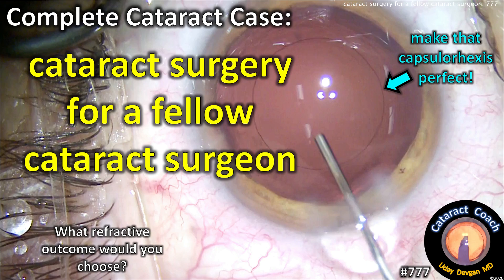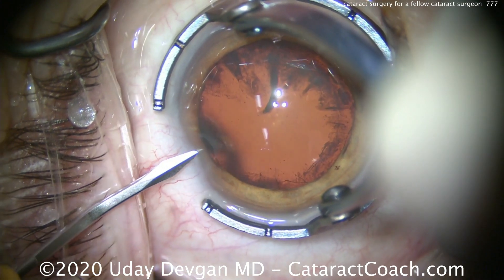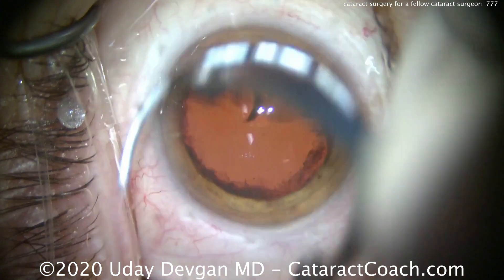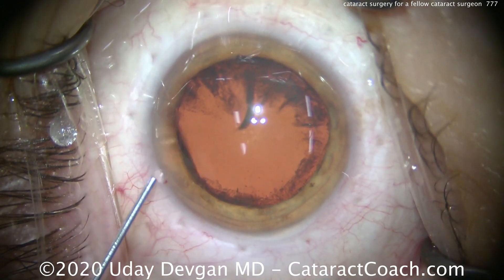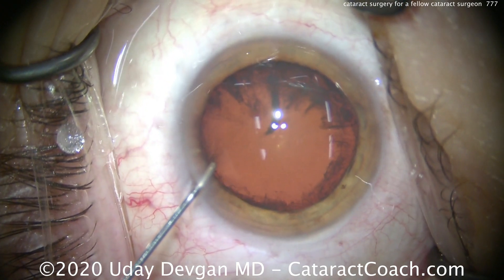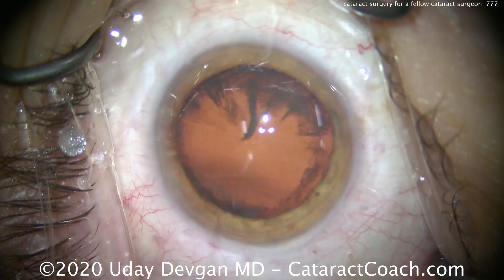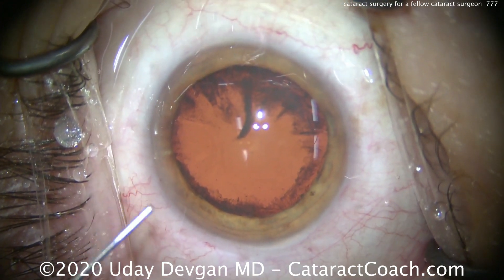CataractCoach.com — cataract surgery for a fellow cataract surgeon. What refractive outcome would you choose? This is always a big honor, operating on a fellow cataract surgeon. This surgeon has done thousands of cataract surgeries over the course of a career, and it's now time for cataract surgery on the surgeon's own eyes. We're very honored to operate on a fellow surgeon, but the stakes are higher.